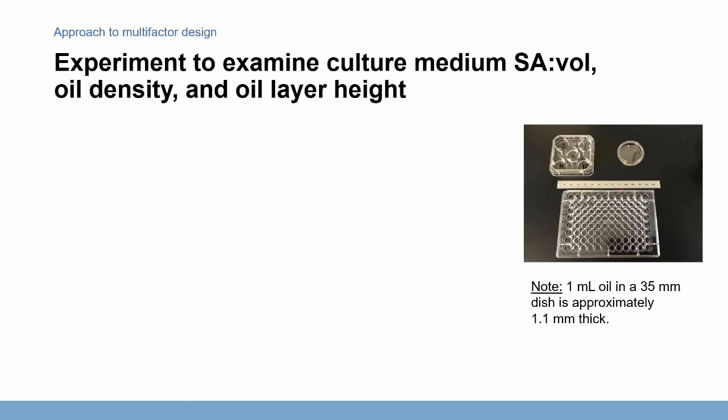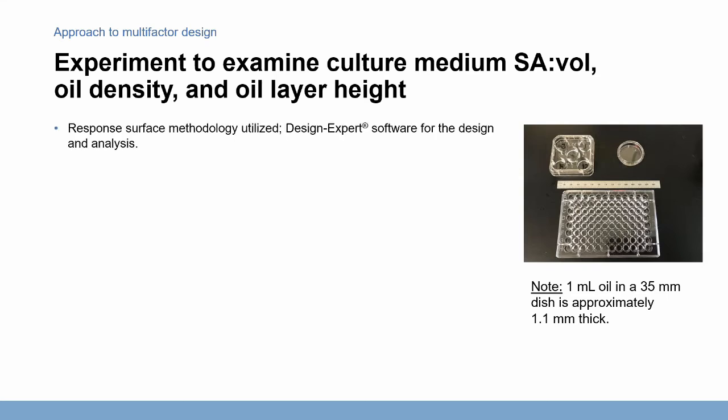And so having done all these preliminary experiments and now sort of intuitively figuring that all of these different factors would interact at least to some degree on this phenomenon, I went ahead and began to dig into how to perform a multi-factor response surface type study using these different variables.